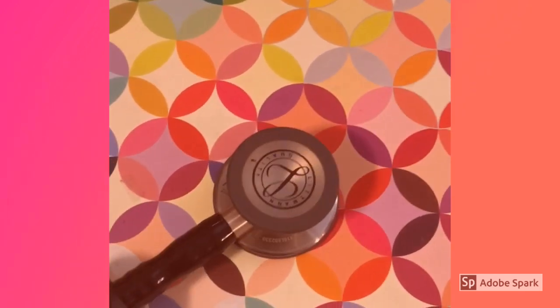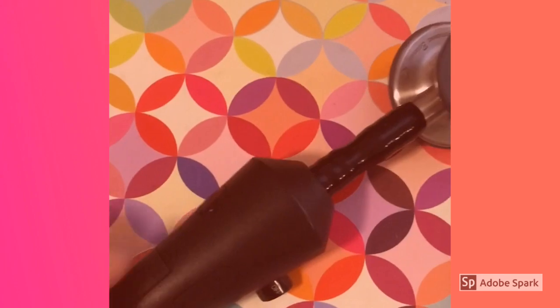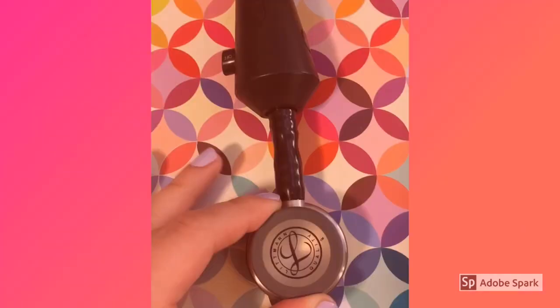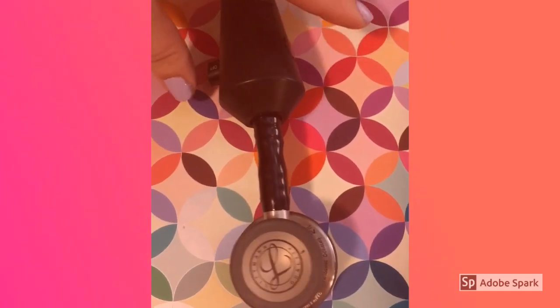Installation was easy. I just removed the head and then attached the echo to the tubing, then I used the attachment piece to put the head back on. I've installed mine so that when the diaphragm is flat, the button moves from left to right.